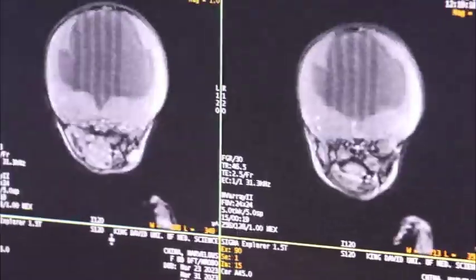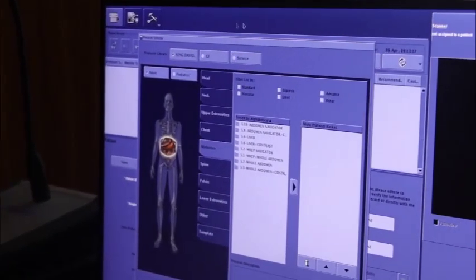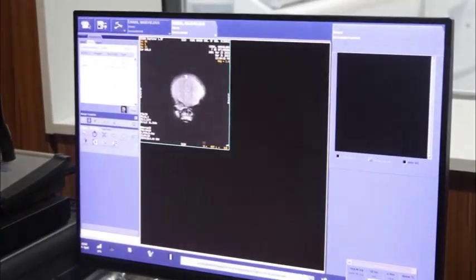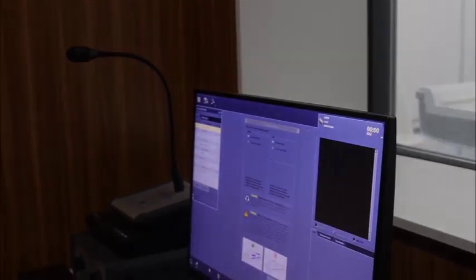So for the brain scan, some of the indications here are brain tumor and hydrocephalus. With this MRI, we can see what is going on, and know if there's any damage to other parts of the brain as a result of the hydrocephalus. Then if someone has an accident and there's internal bleeding, what we call hematoma, maybe there's blood somewhere that may disturb the functioning of the brain, this MRI can pick it. There are many others. Maybe there's a tumor in the brain, a growth somewhere in the brain. This MRI can pick it. Remember I said it's very good for soft tissue differentiation.